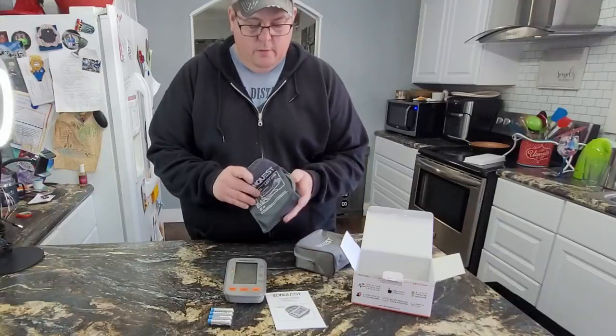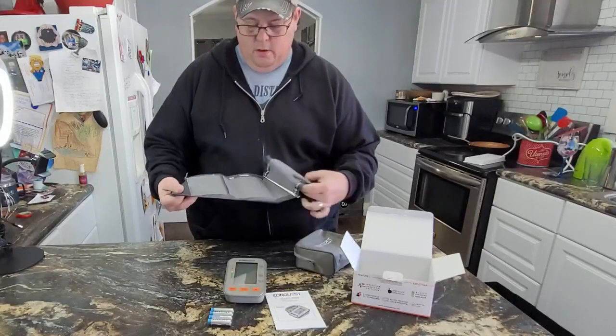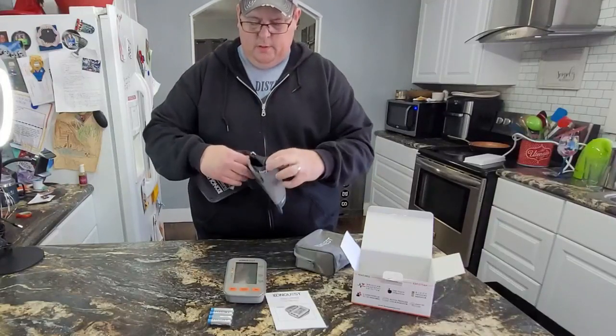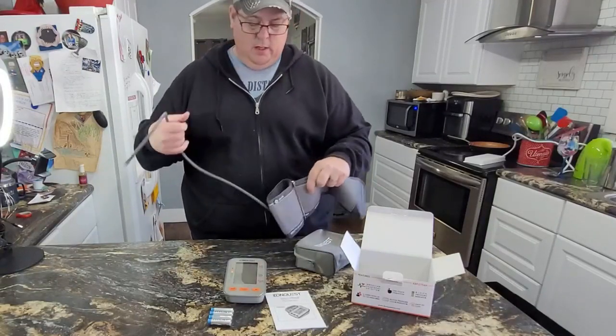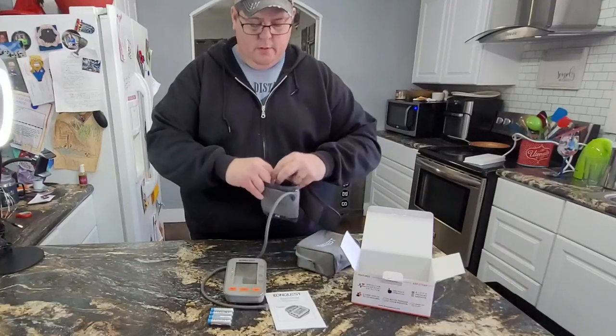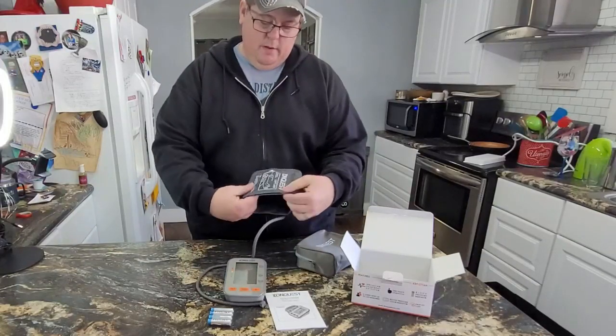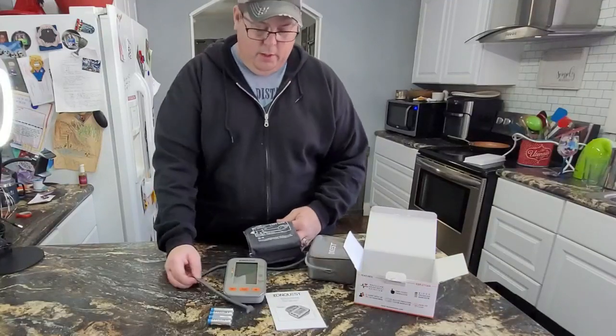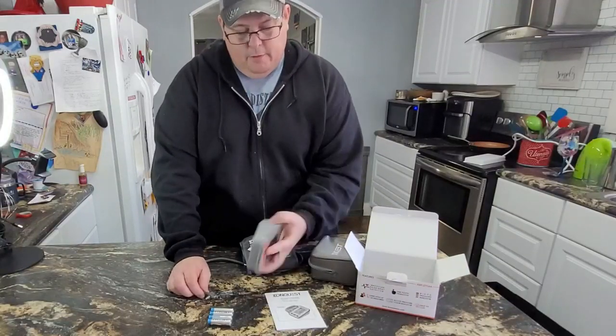And then you'll have your arm cuff, which also has your hose. Of course, your arm's going to go inside. And it even tells you left arm this way — really kind of dummy-proofs the thing all the way.